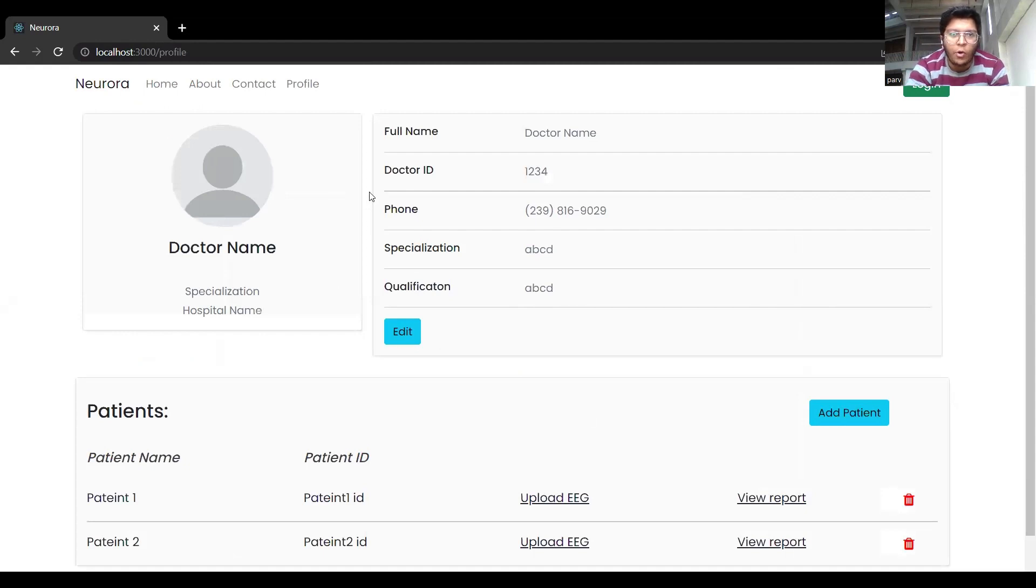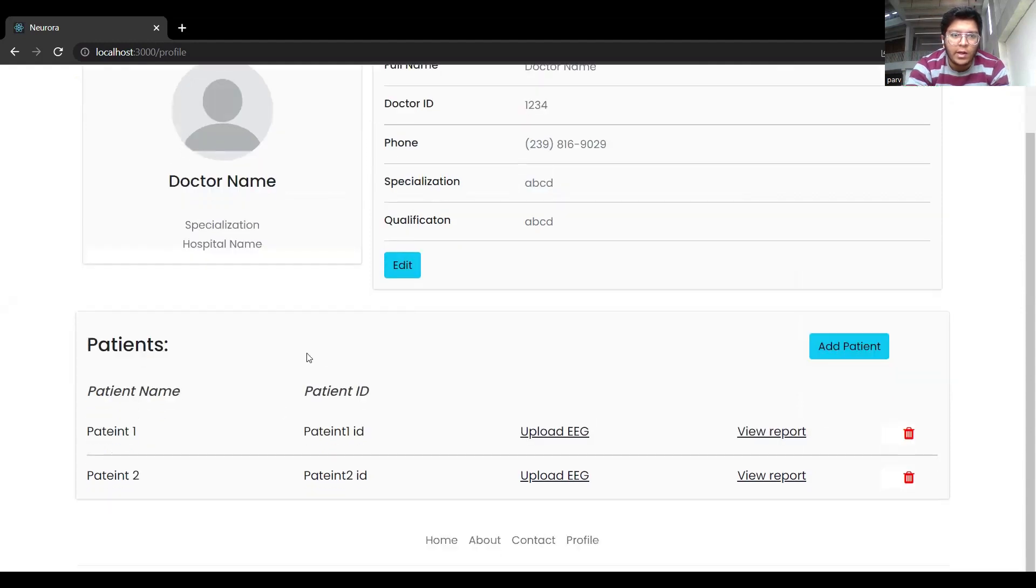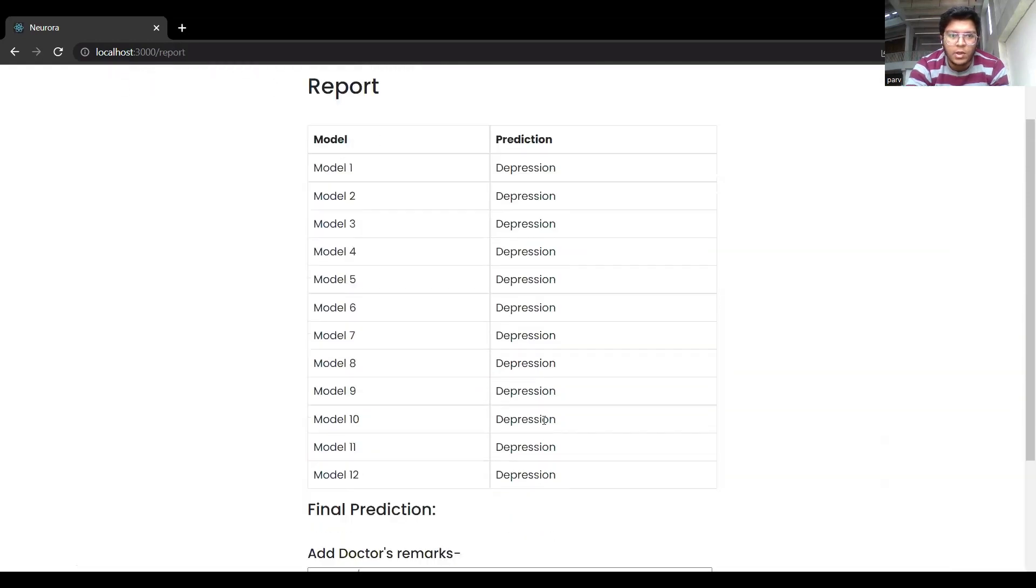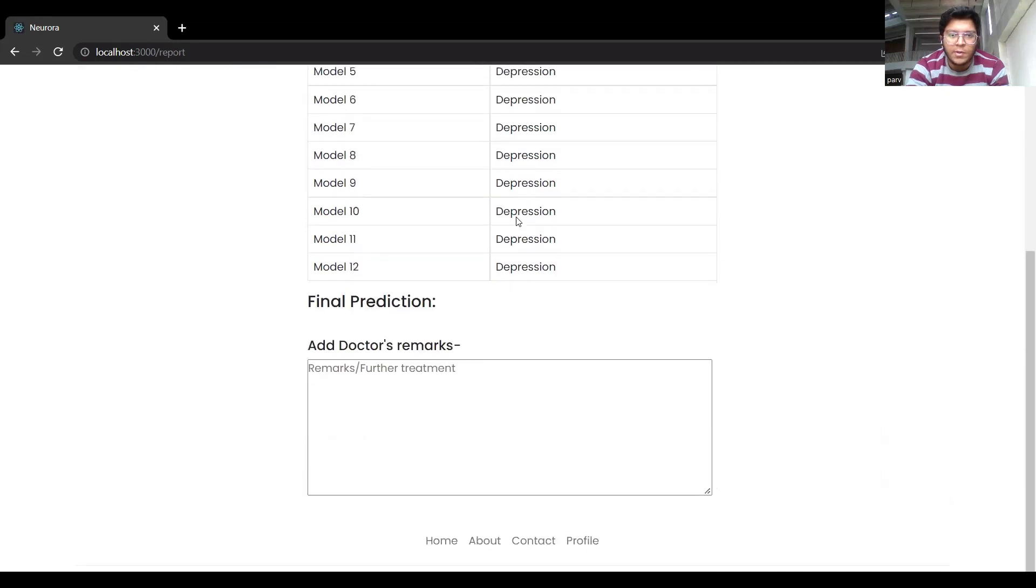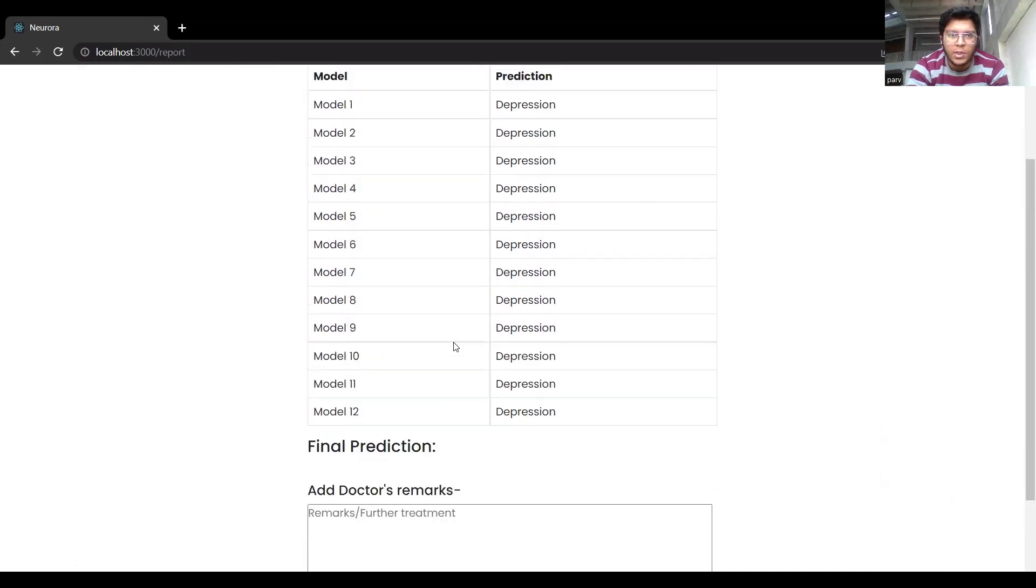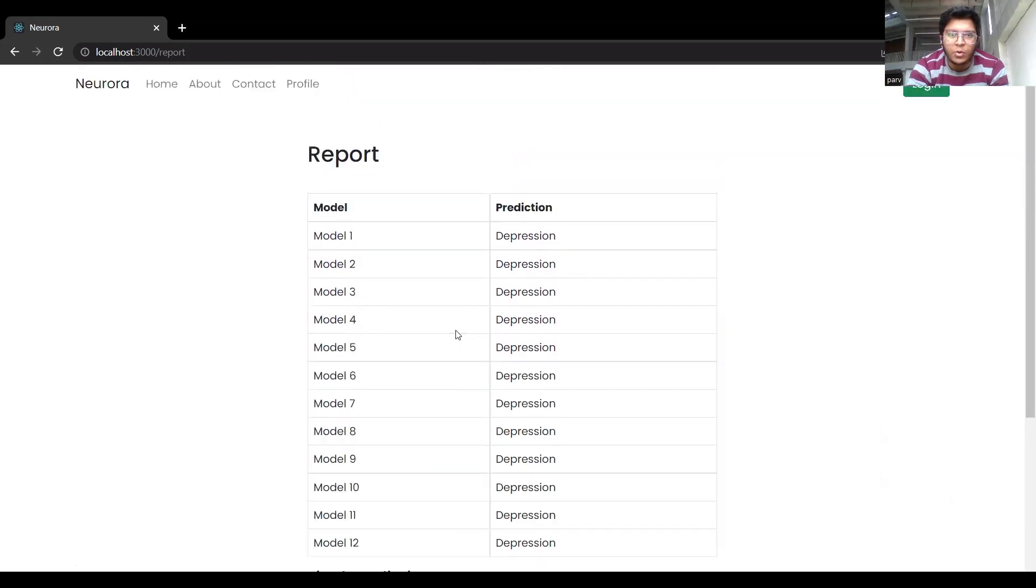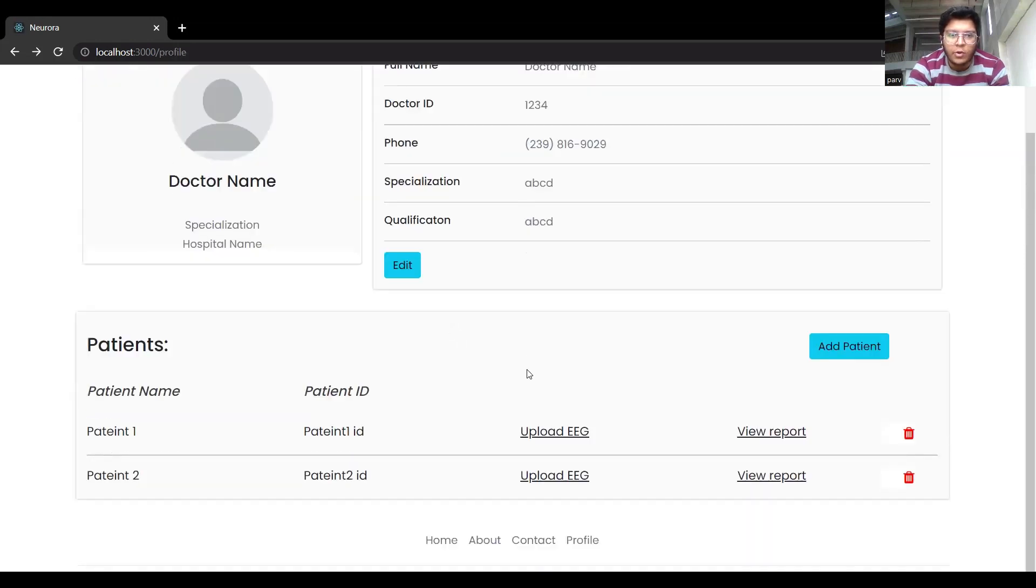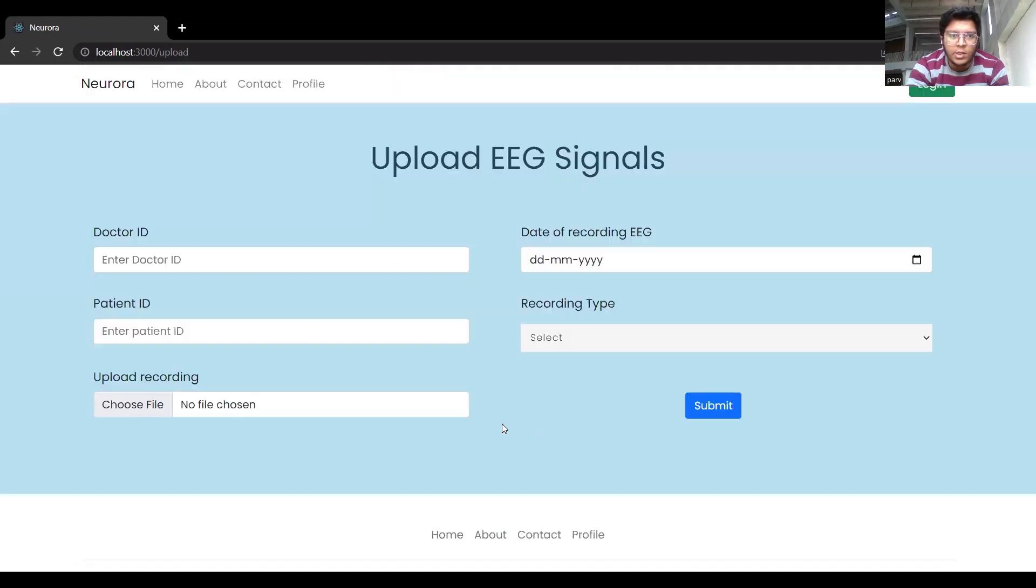So you can see all the details required for the doctor are here. Name, doctor ID, phone number, everything. And there are different patients here. So you can view the reports of different patients. Like depression has been diagnosed in this patient's report. And you can also upload new EEG signals here.